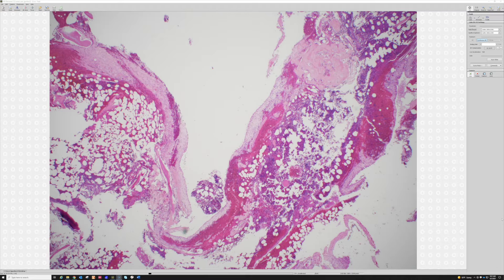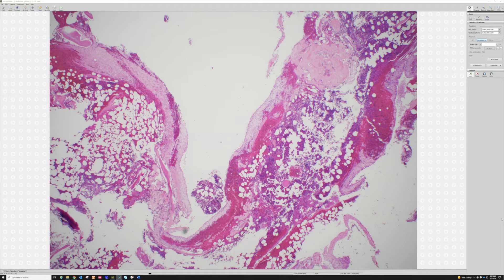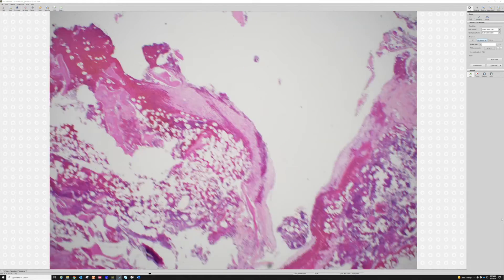This is a lytic, lucent lesion in the medullary cavity, in the metaphysis of the proximal femur of a 10-year-old boy — I'm making that history up, but that would be a characteristic radiographic and clinical presentation. An MRI would show that this lucent lytic lesion is actually a cyst, filled with water-density fluid.